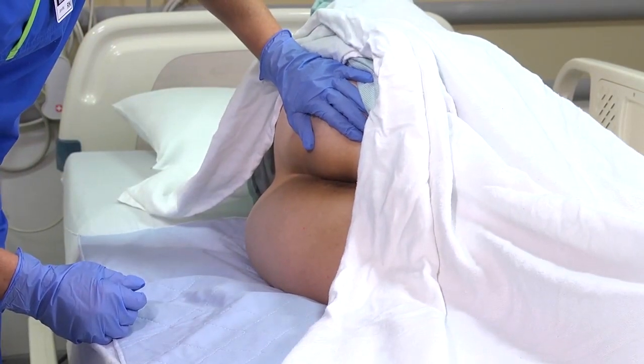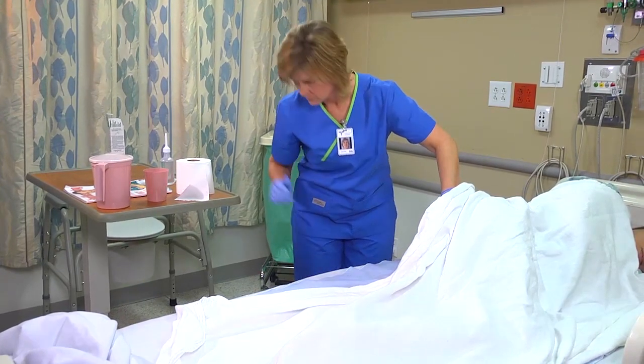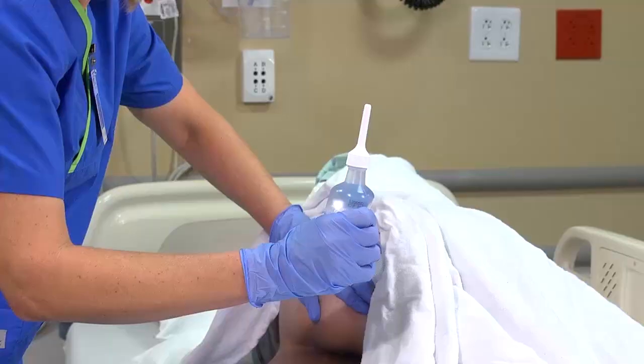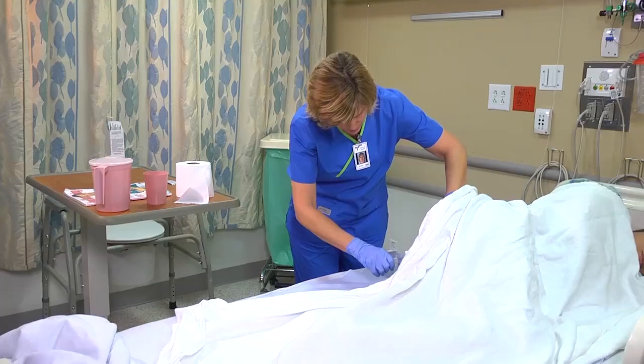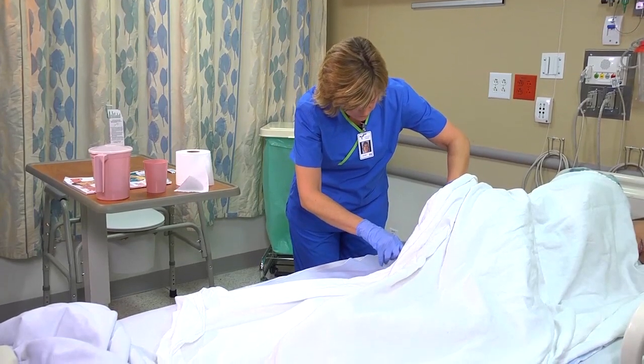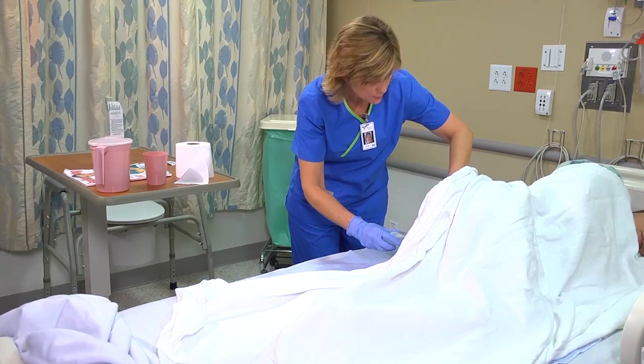Now, separate the buttocks and inspect the perianal area for abnormalities, such as hemorrhoids, anal fissures, and rectal prolapse. Gently separate the patient's buttocks and locate the anus. Help her relax by coaching her to breathe slowly in and out through her mouth.